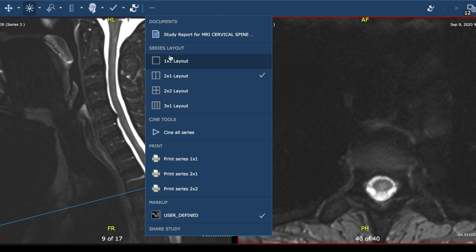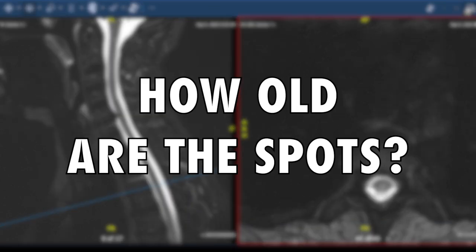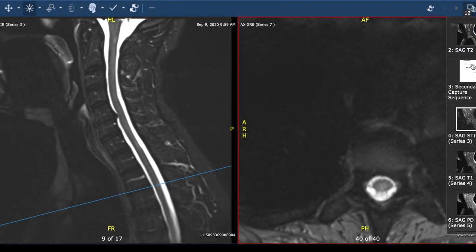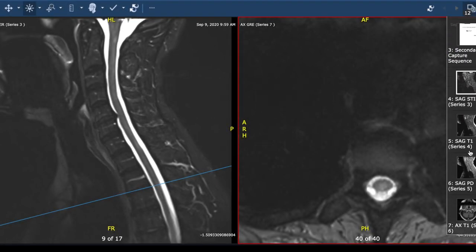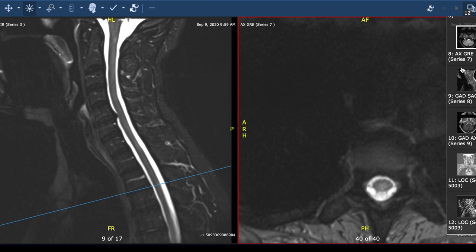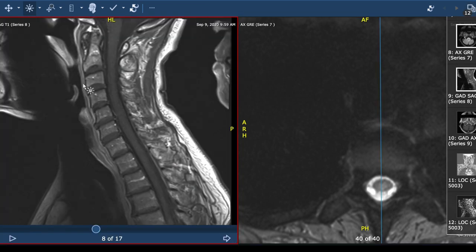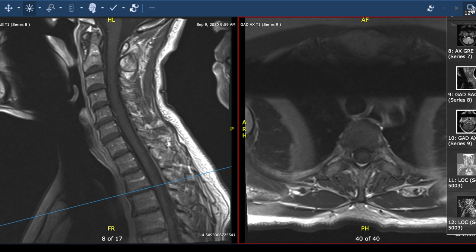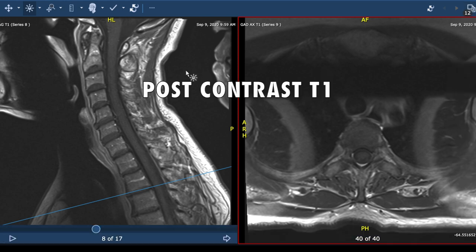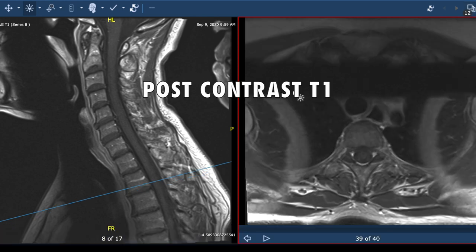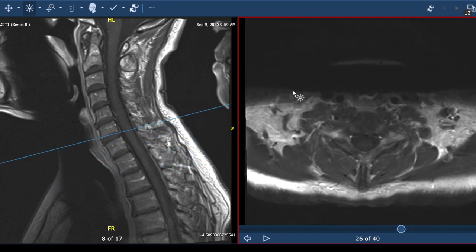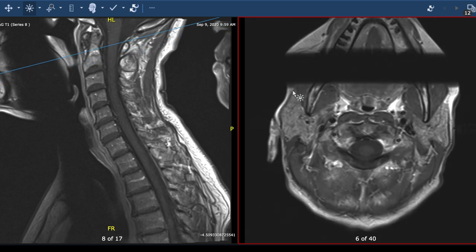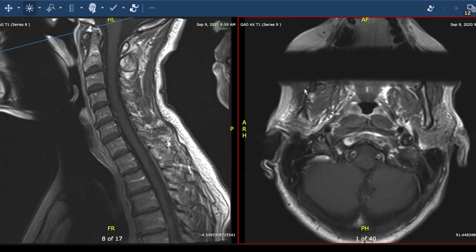We can ask ourselves questions about how old the spots are. One way to do that is to look at the administration of contrast and see if any of those lesions light up. So let's do that together. I'm keeping the side view on the left and the top-down view on the right, but I've changed the picture to after the administration of contrast. Fortunately, there's no abnormal contrast enhancement throughout the entire cord. That's very reassuring, telling us that none of those lesions are new.